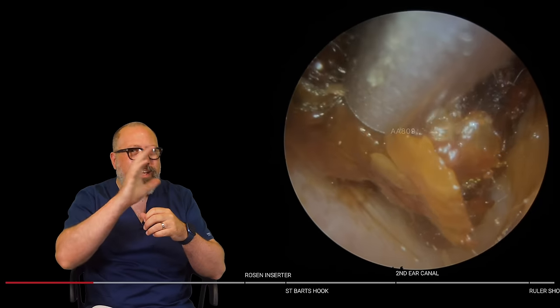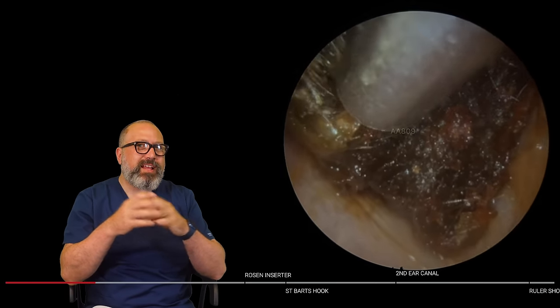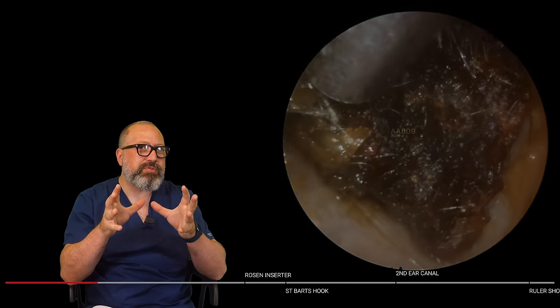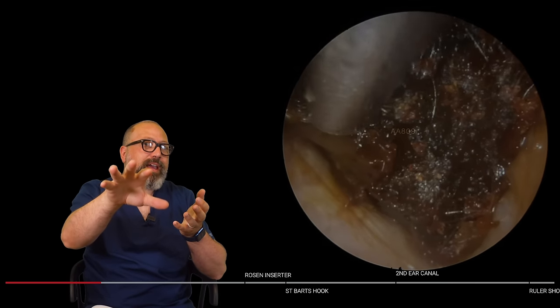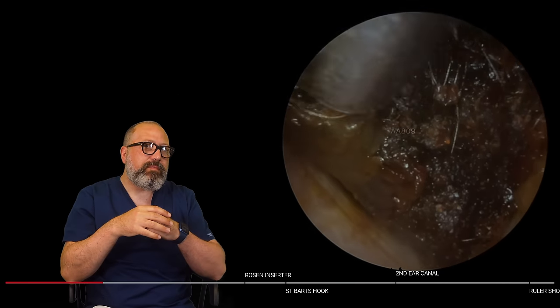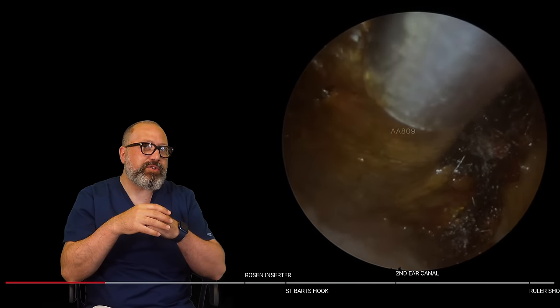There we go. You can see that skin underlayer there as well, where it just hasn't been able to migrate out. That softer section, look how all those bits are just disappearing into the end of the suction tube as soon as you get a placement on top of that plug. Now we can really see the back end of this wax plug just starting to move. We're giving this a little bit of a wiggle. There we go, we're trying to spin it here.